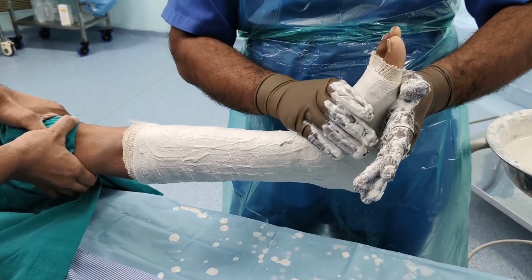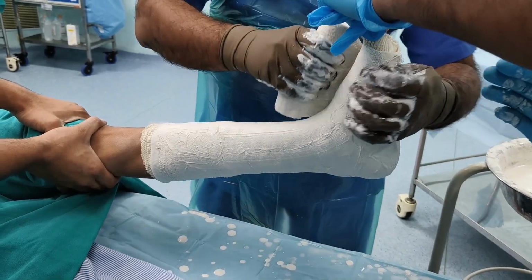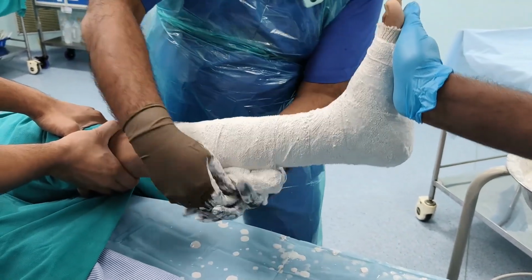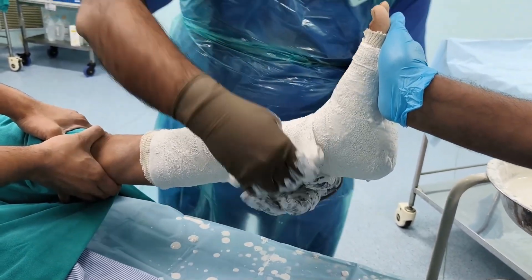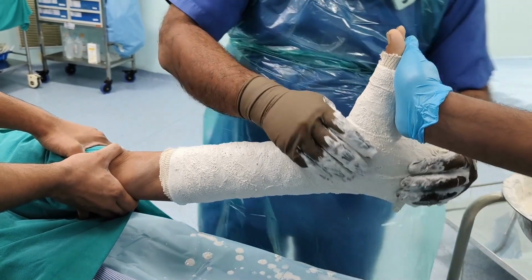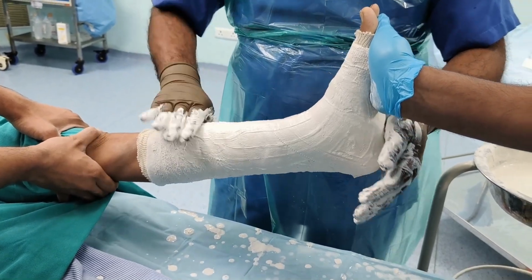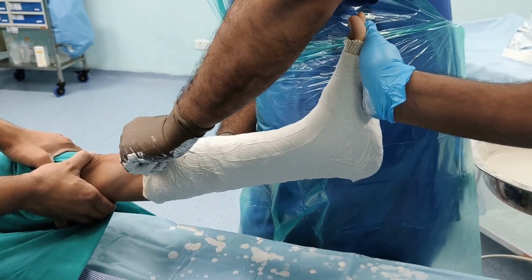So this is not adequate, yet we have to apply more POP. So I have taken the third POP roll and I am applying it gently, repeating the same thing which we have learned so far. And now I can see that I am about to reach the adequate cast dimensions which I need. So at this point you have to just hold the edge of the stockinette and pull it down.